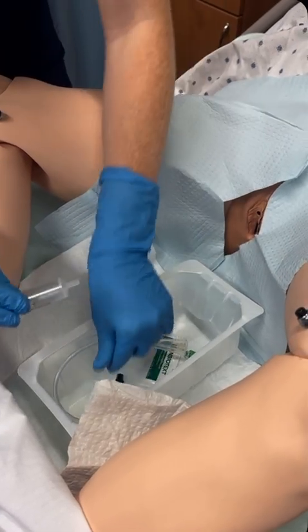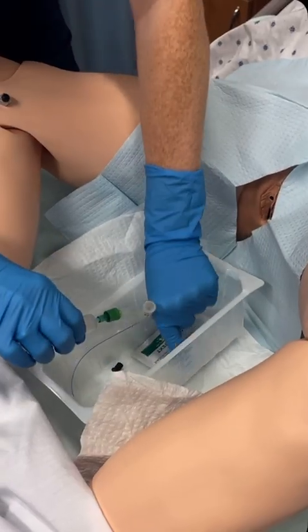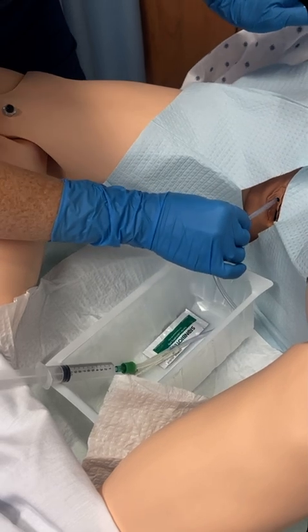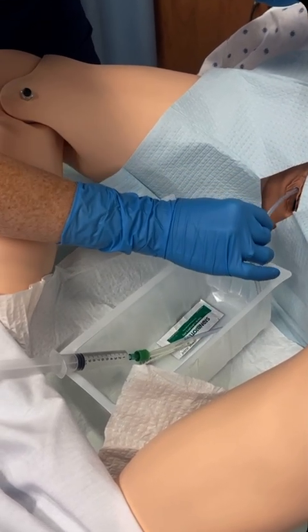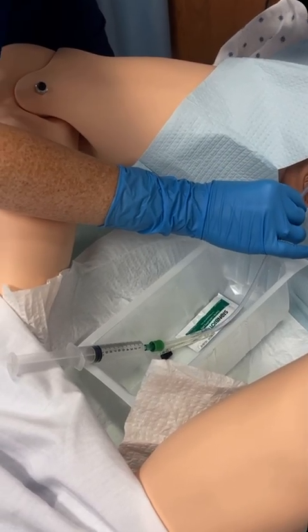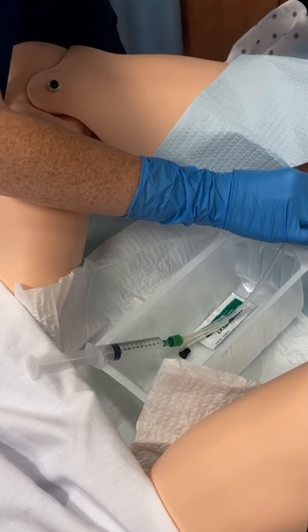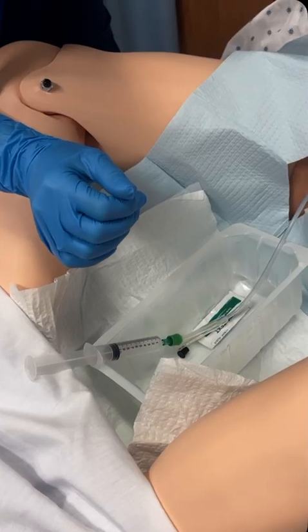Insert catheter until urine flows, approximately 5 to 7.5 centimeters for assigned female at birth, or 17 to 22.5 centimeters for assigned male at birth. When urine appears, advance the catheter another 5 centimeters. Do not force resistance. Maintain surgical asepsis throughout the procedure.